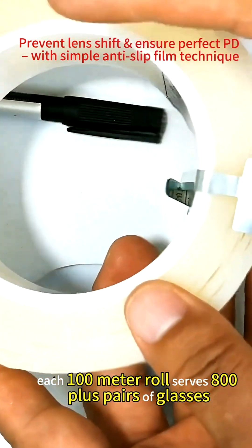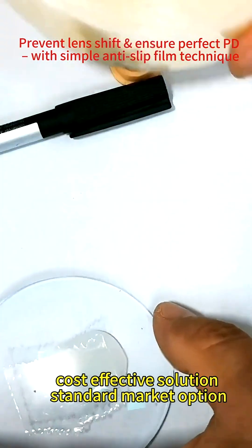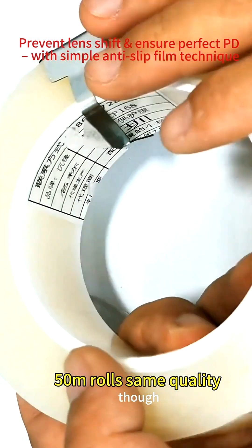Each 100-meter roll serves 800-plus pairs of glasses — you do the math. It's a cost-effective solution. The standard market option is 50-meter rolls, but the quality is the same.